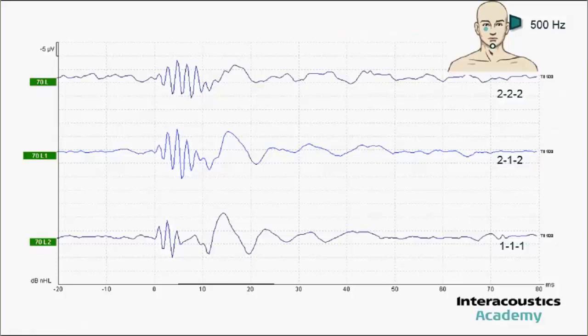And so there's a number of ways to control that. It's perhaps more complicated than the traditional ways to control it using air conduction, where, of course, with a tube insert phone, we can physically separate the transducer from the electrodes, and the time delay as well, where the sound propagates through the tube, also temporarily separates the artifact from the response. But with the bone transducer, we don't have these options available to us.